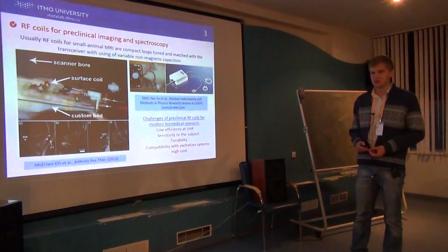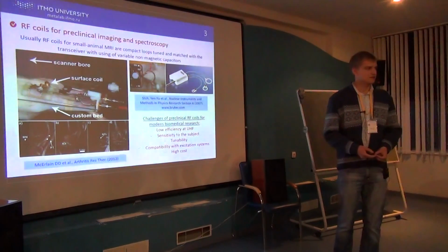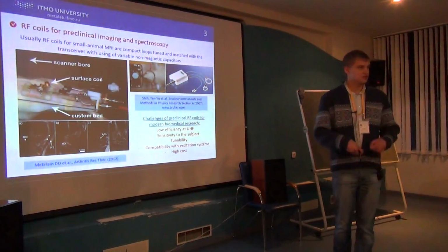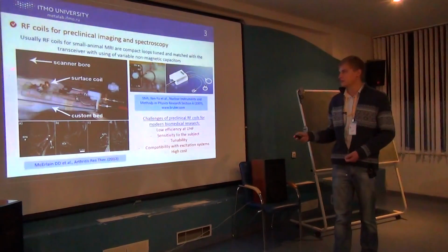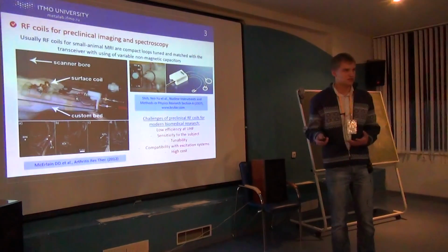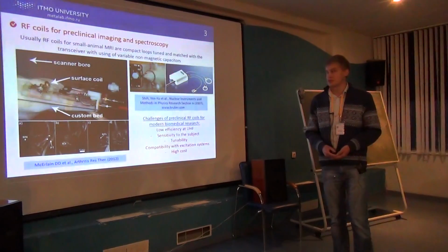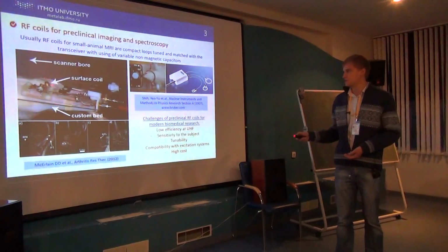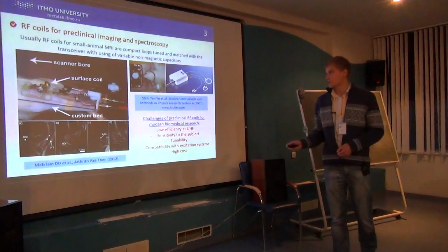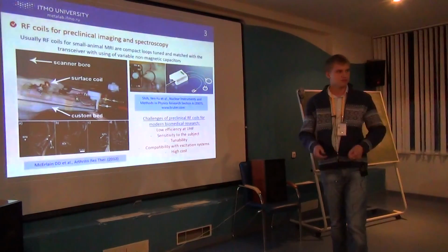And finally, in order to use these coils, you need to tune and match the coil every time before you want to make a scan. For example, if you move the antenna a little bit inside the machine, or you replace one subject with another, you need to retune the coil again. For this purpose, these coils are usually tuned to the Larmor resonant frequency by means of lumped variable capacitors, which are depicted on the slides here. In order to tune and match the antenna, the capacitors must be tuned by means of special very long fixtures which you need to rotate every time before the scan.